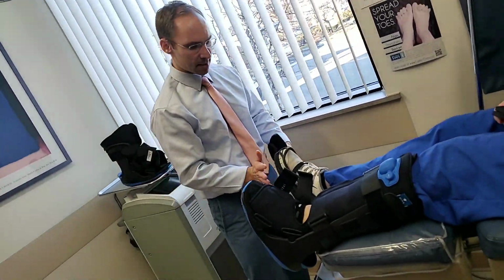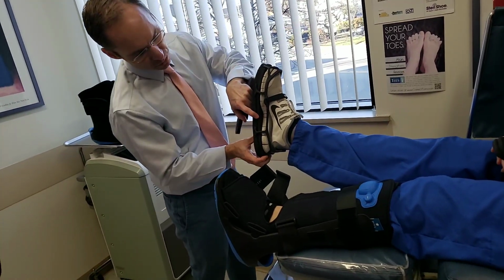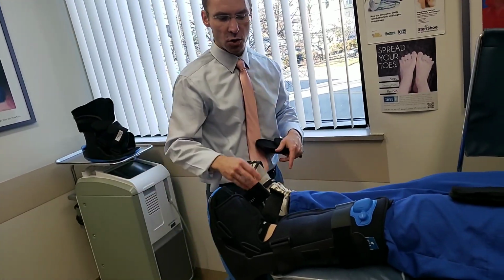But the key to these is when you're walking with it, you're going to have this even up on the other foot. So this is going to even up so you're not going to throw your back off, your hip off, or any other problem. So these are a short and a tall walking boot.